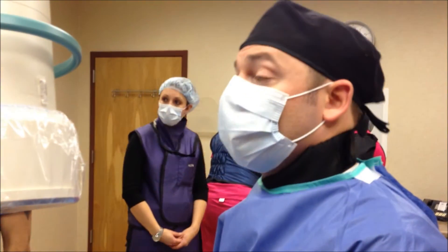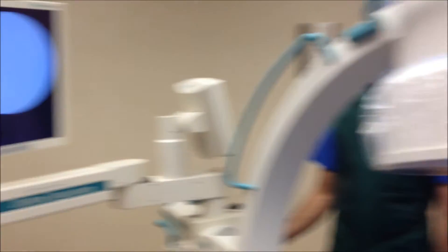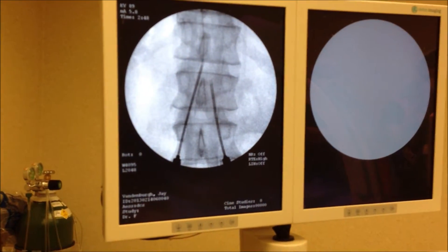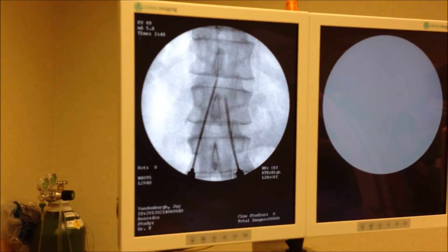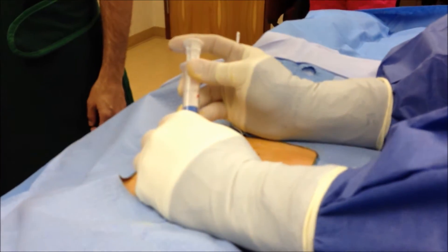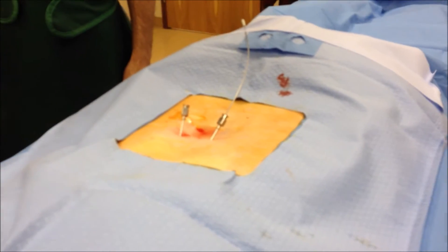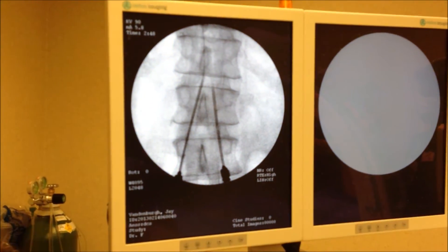We're going to go for a loss of resistance here. If you look where I am on that camera there, we are right on the interlaminar, right on the laminar surface. I'm going to advance and slowly — look over here — you're going to look for my loss of resistance, and we're in. That looks a little bit lateral, but that should work for us. We bounced off the spinous process a little there.